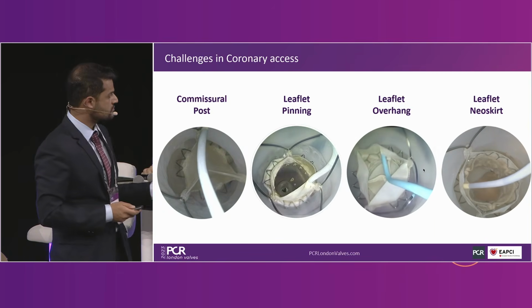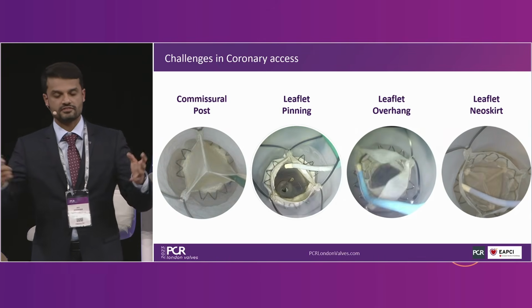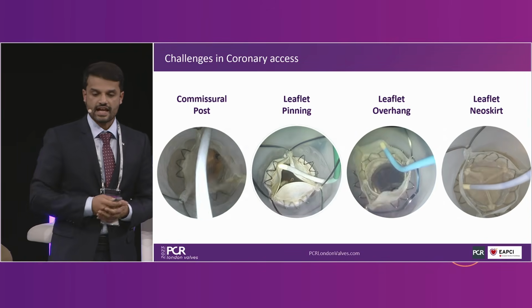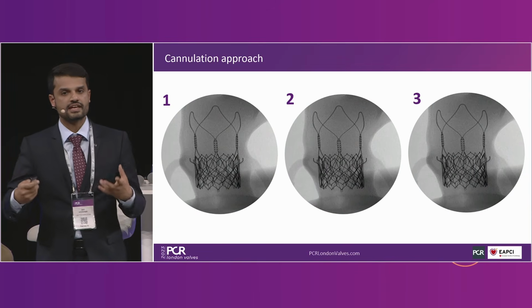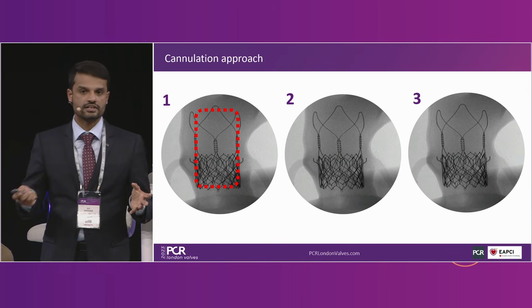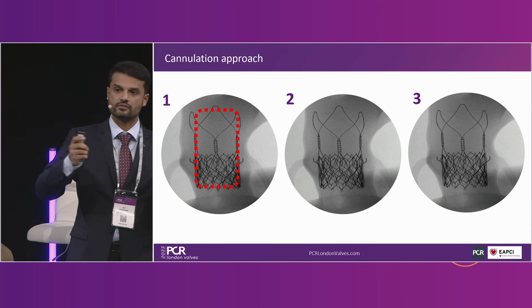We've already touched upon some of the challenges and problems that we can have across, again, the spectrum of TAVI procedures. So we've got posts, leaflets, leaflet overhang, and these are all the obstacles and barriers that our catheters face. I want to give you a slightly different way of thinking about these things, because essentially it's just a geometrical problem. A lot of our barriers are centrally located. All of the problems that we have are in the middle portion.